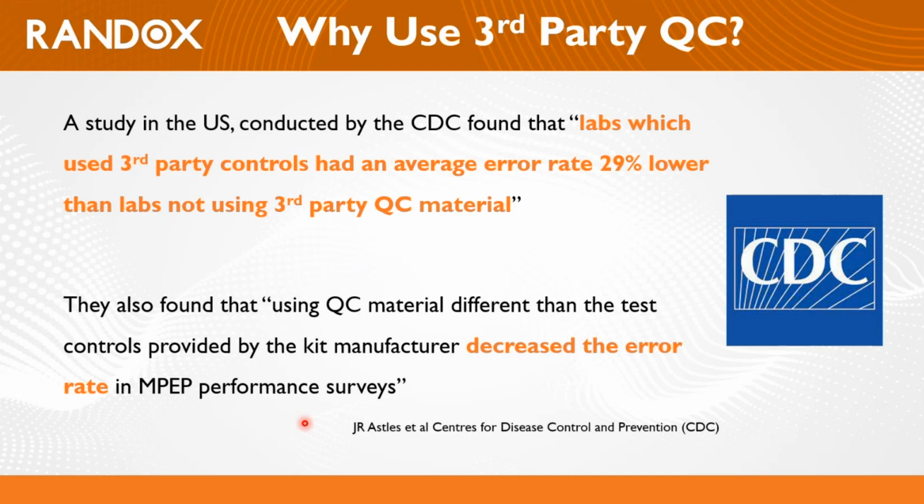Now, what does MPEP stand for? MPEP stands for Model Performance Evaluation Program, which the CDC uses to assess the performance of labs that test for recognized diseases, such as HIV. So we can see that using third-party controls helps in improving lab performance. But why is that the case? Well, we've discussed why that is the case in this whole presentation so far. So I hope you've been paying attention, and I hope my point is resonating with you.